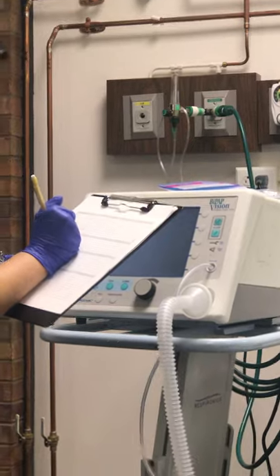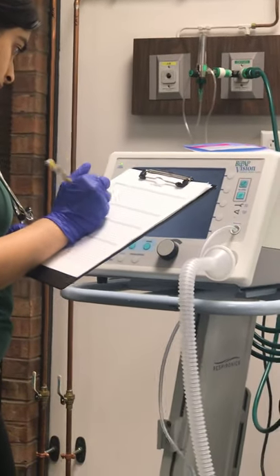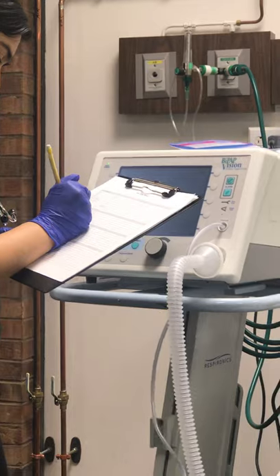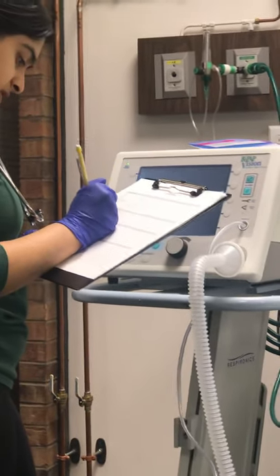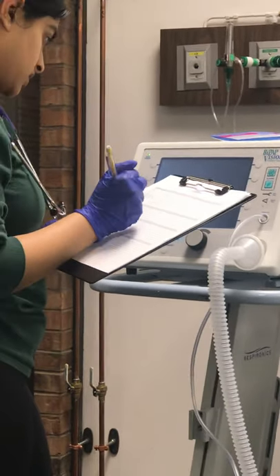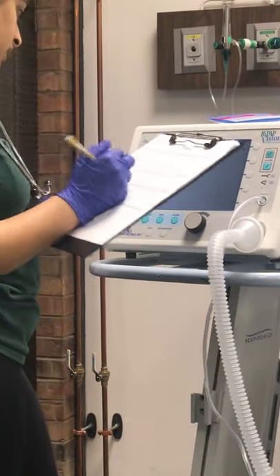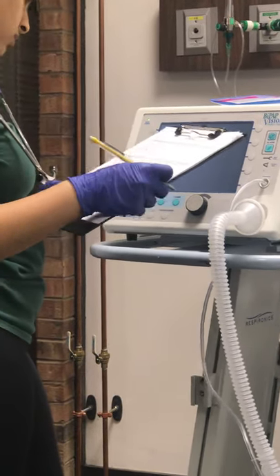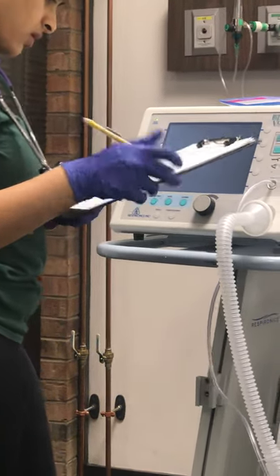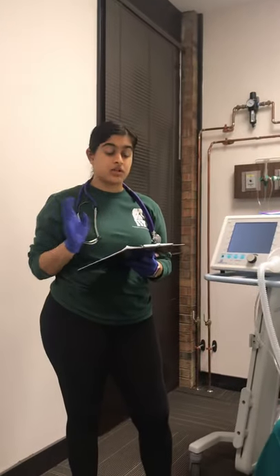The patient's respiratory rate is at 16, not 13. She's at 18 for minute ventilation. Her PIP is at 14. Her leak is at 9, which is good. So I'm just going to document everything and let the nurse and doctors know the changes I have made.